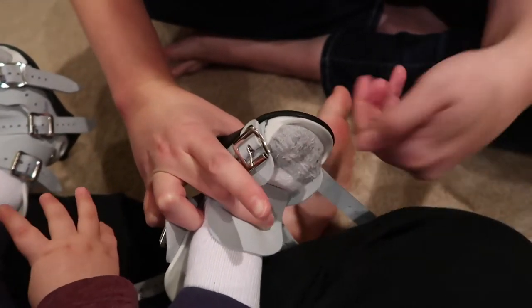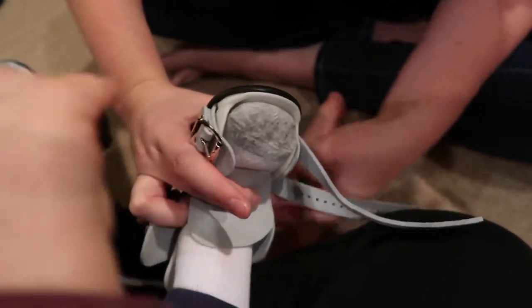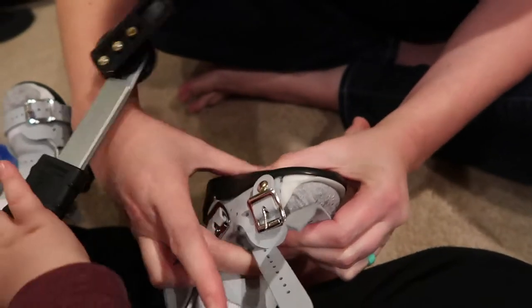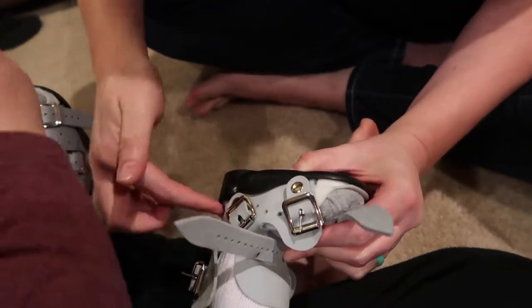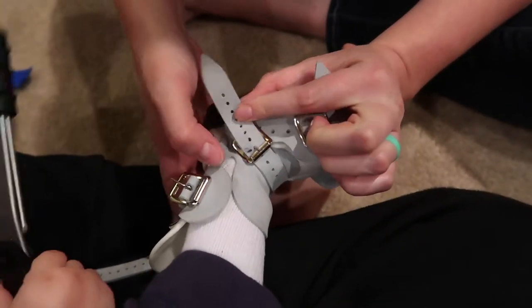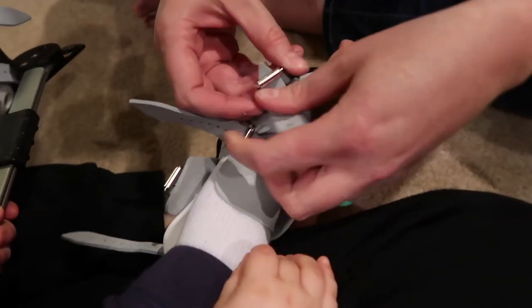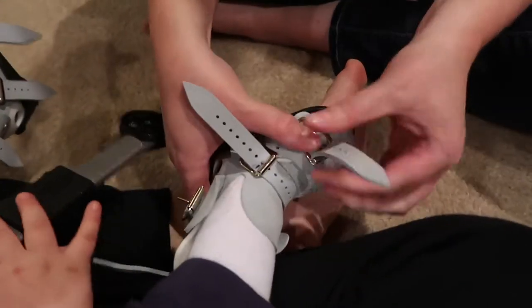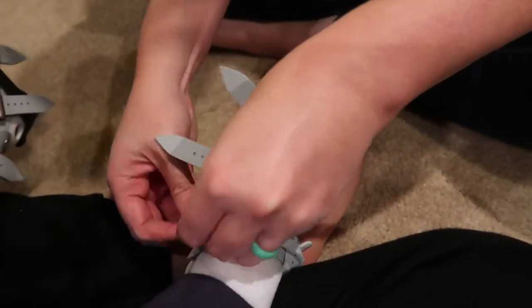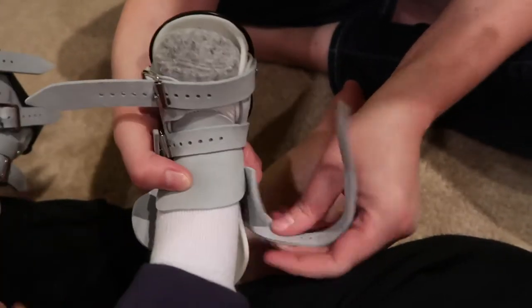Let go with one hand and hold pressure with the other, making sure everything is down flat. Continuously keep that pressure or else the heel will slide. Then put the buckle on, check that the tongue is down, and it's easy to do the next two. Always check to make sure everything is on there straight with no wrinkles.